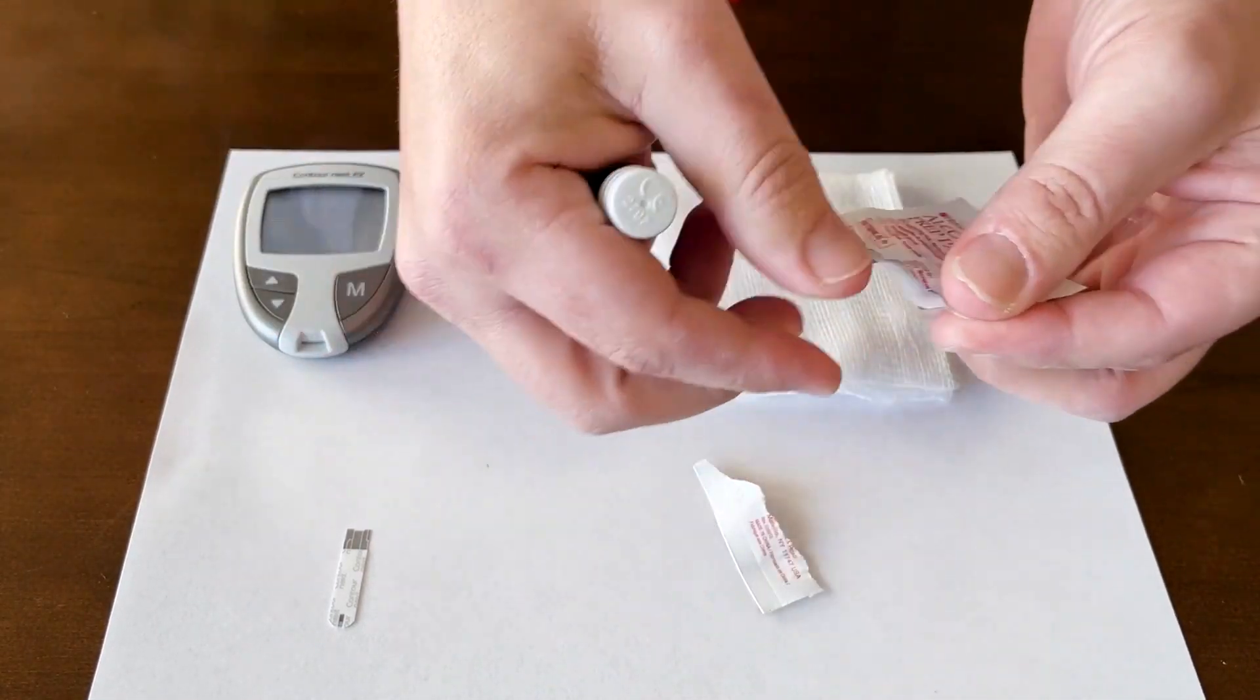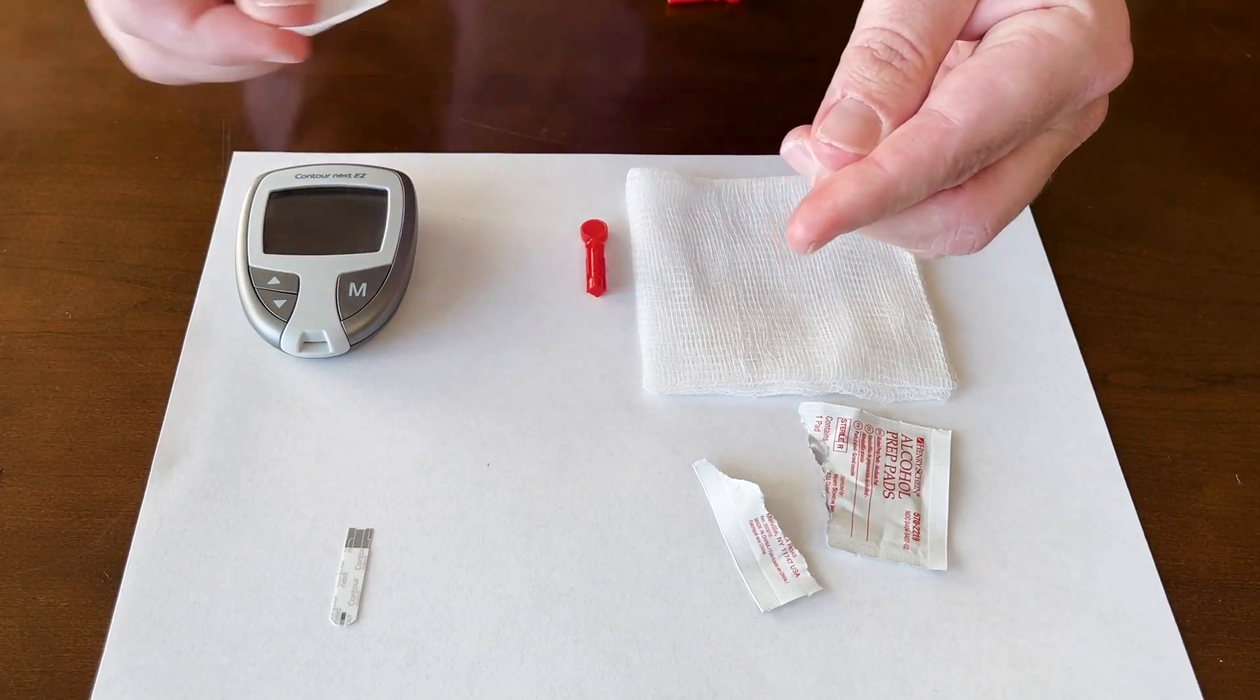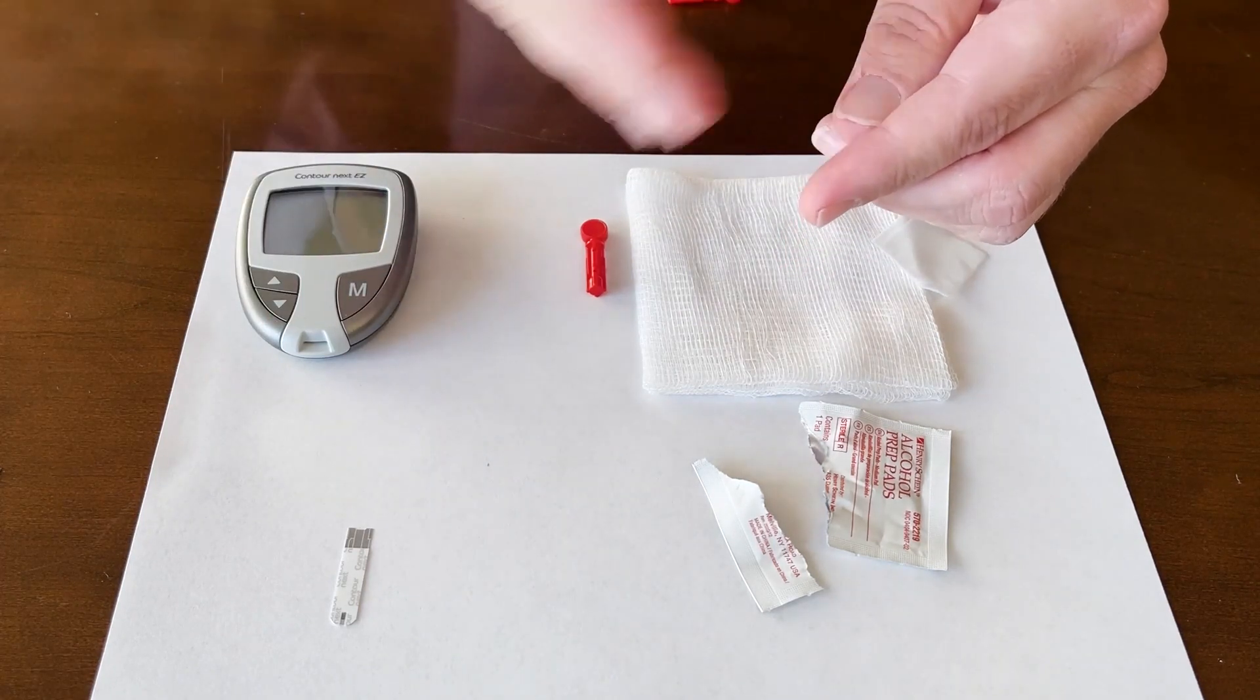We're going to take our alcohol swab. We're going to find the finger we're going to do, take the alcohol, and then we're going to let the alcohol evaporate.